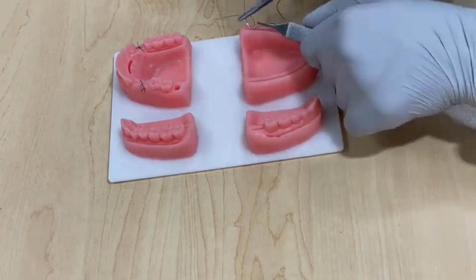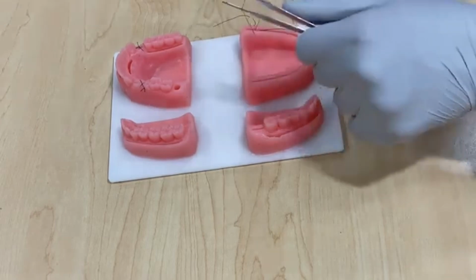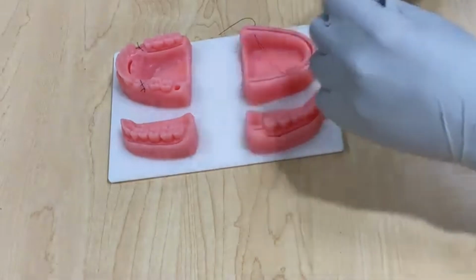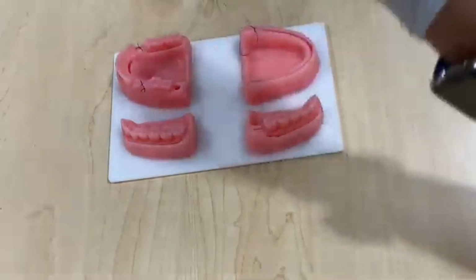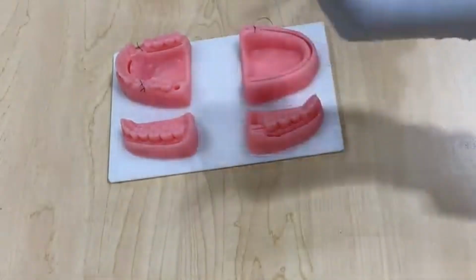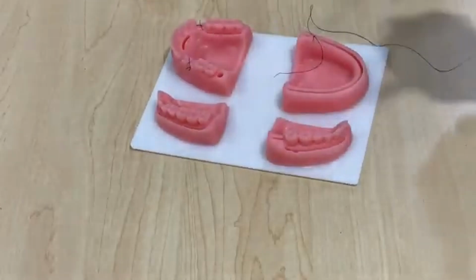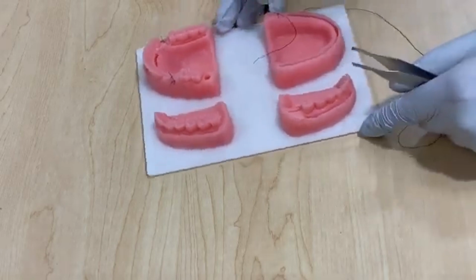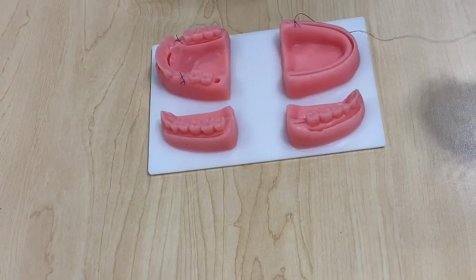Alright, you want to go to the lingual palatal, just like what we did. Just do your simple interrupted. Okay, 2 loops toward the short tail, pull across, 1 loop toward the short tail, pull across, and then 1 loop toward the short tail, and pull across. Alright, perfect. So now, instead of cutting both ends, you'd want to cut only the short end, okay? Just the short end, cut it, perfect, you're good. Alright.